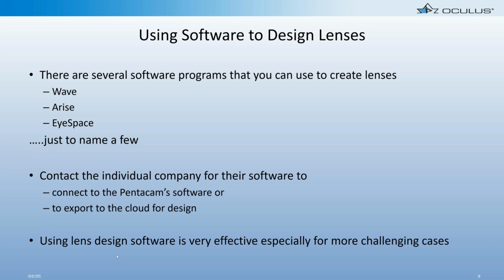Again, lens design software I find is not always necessary for the straightforward patient, the patient with no astigmatism, low prescription. A lot of times they're pretty straightforward and easy. But if you want to take on more challenging cases, absolutely, using software makes it much easier for us.